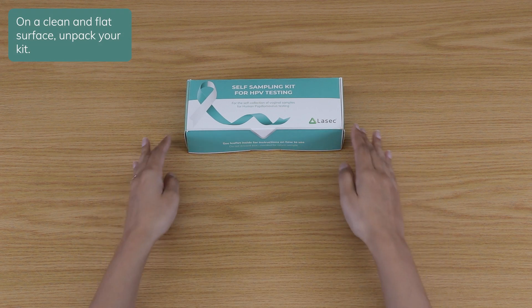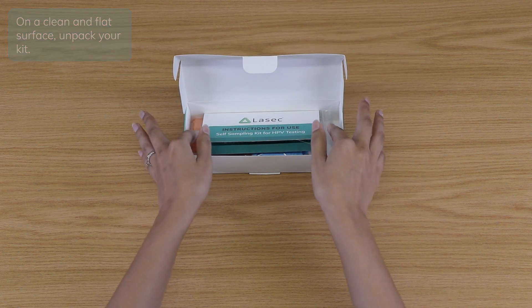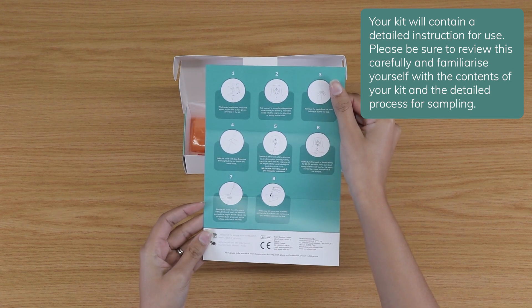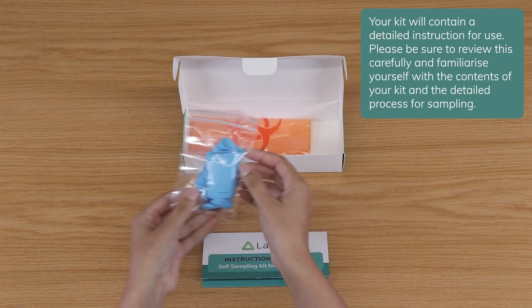On a clean and flat surface, unpack your kit. Your kit will contain a detailed instruction for use. Please be sure to review this carefully and familiarize yourself with the contents of your kit and the detailed process for sampling.